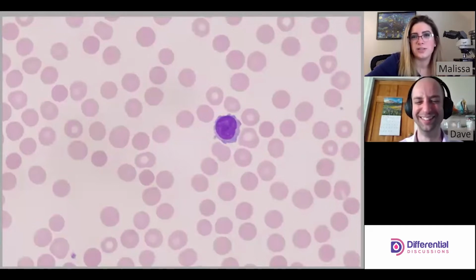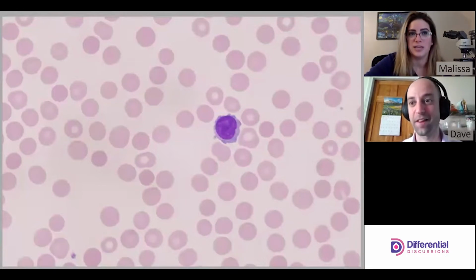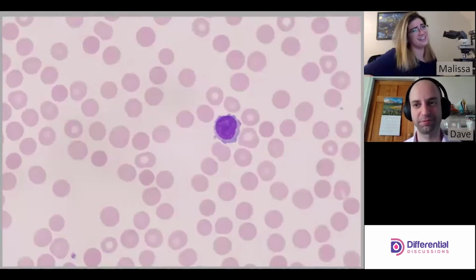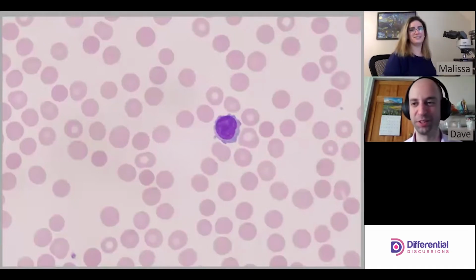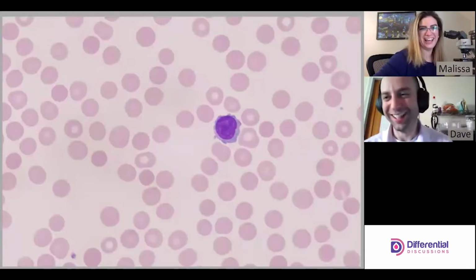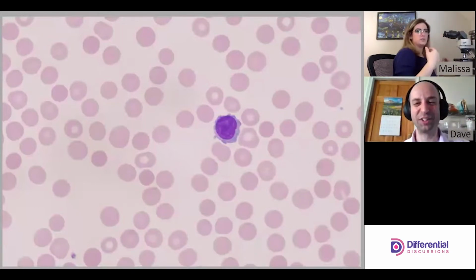Just for those of you who aren't yet aware, AML is acute myelogenous leukemia. Leukemias have really challenging immature cells if you haven't done it yet, and even if you have done it, it's still challenging. Thank you for the contextual statement. Sometimes we just spill the jargon and go. We'll try to catch each other.